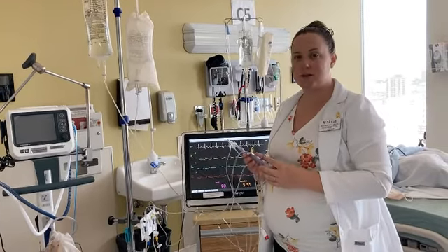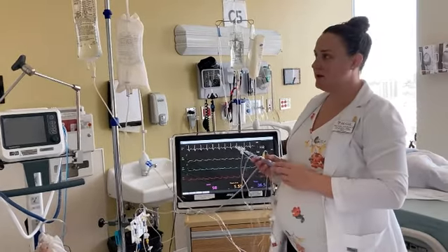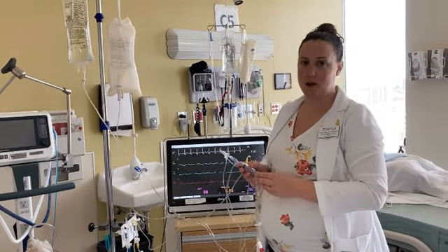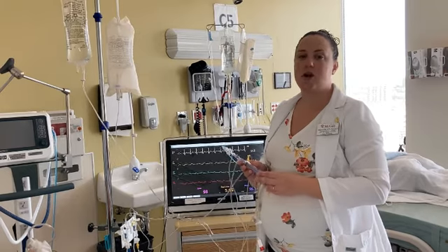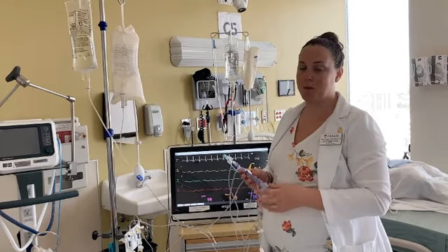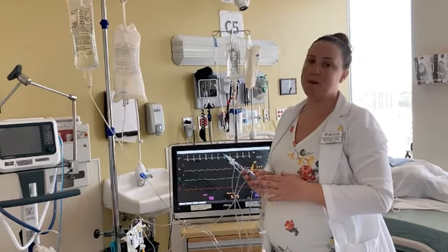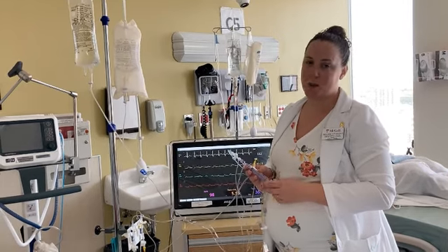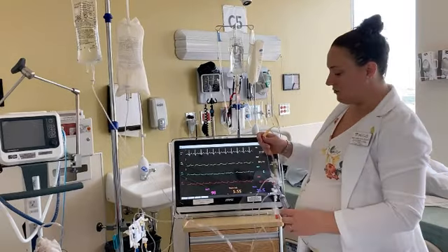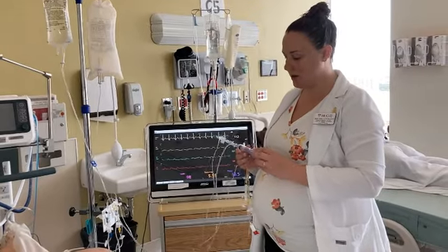It's going to be injected into the body that has its core temperature labeled here on the screen. And depending on how much time it takes for that 10 milliliters of water to warm up, it'll give us an indication of cardiac output, so how well the heart is pumping. The quicker it warms up, the quicker the heart is pumping blood forward, therefore the better the cardiac output. The slower it warms up means the slower the cardiac output is, so our cardiac output number will be lower.